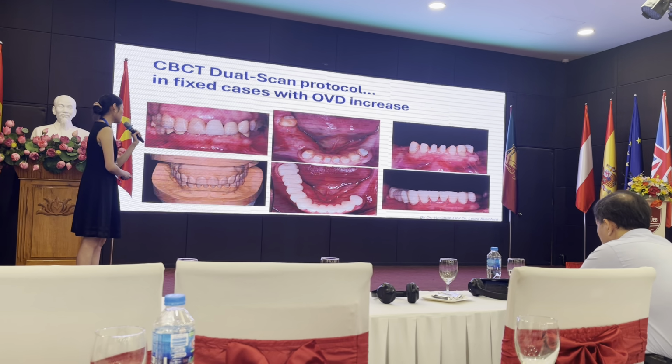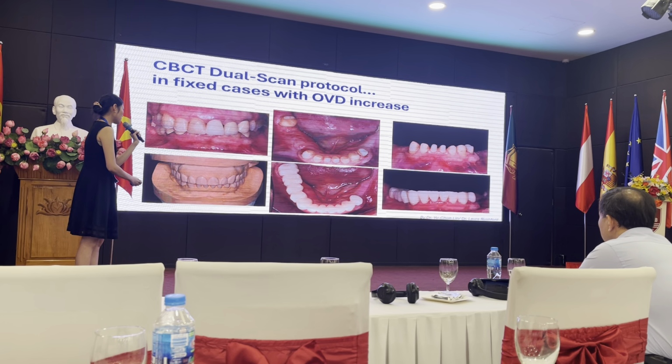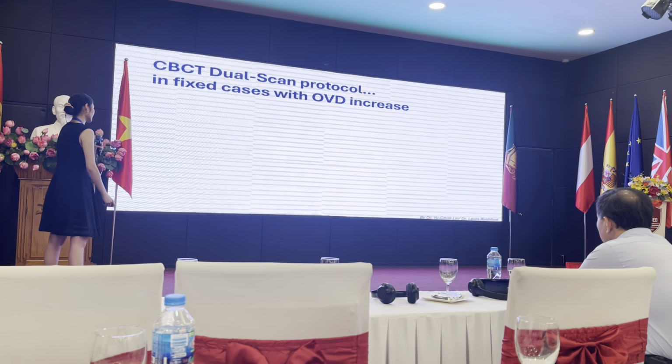Như trong trường hợp này bệnh nhân có một cái khớp cắn sâu. What I did first was I did the diagnostic wax up at an increased vertical dimension. And after that, I duplicate this wax up and started my tooth preparation. And then I deliver the provisional at an increased vertical dimension. Lắp răng tạm cho bệnh nhân ở cái vị trí tăng kích thước dọc này.